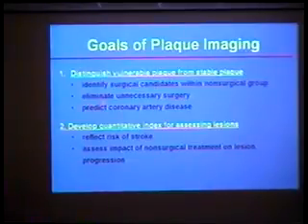We're also hoping that we can use carotids to predict coronary artery disease in some fashion, especially since there have been pretty extensive reports of using ultrasound carotid imaging as a predictor of coronary disease overall. We believe that the direct measurement of carotids, as we're doing with MR, should be a better predictor than what ultrasound can provide by simply looking at the vessel wall thickness.